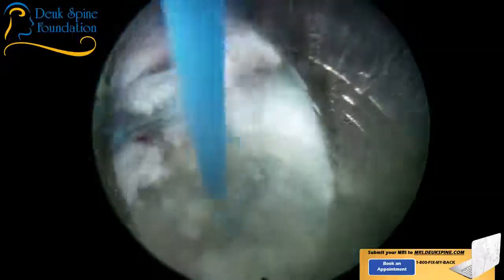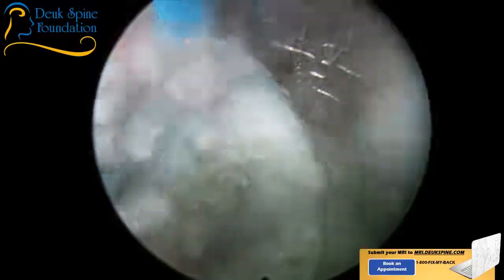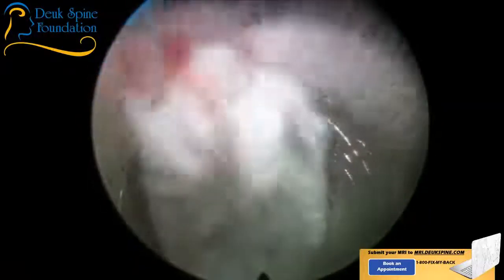All right, there's the tear right there. You all see that? It's pretty ugly. That right there is the tear. A little bit of fat coming out.